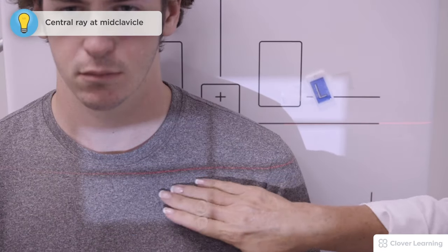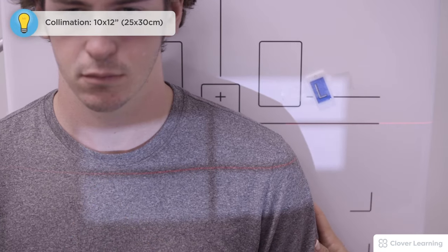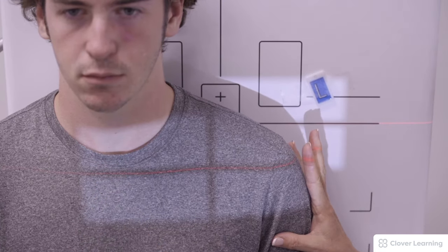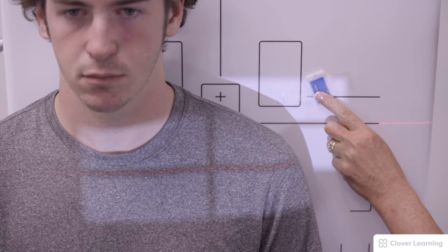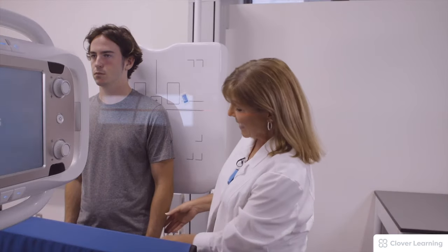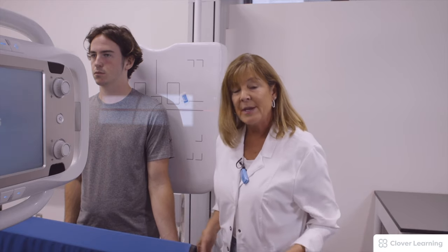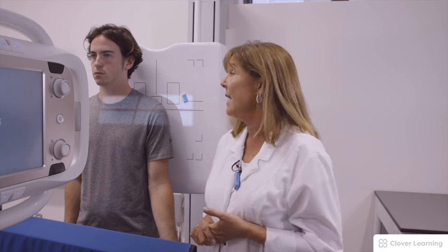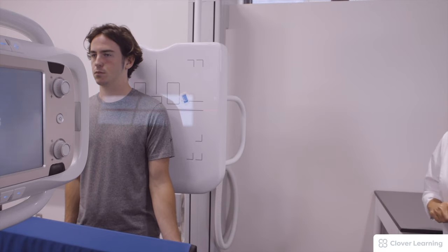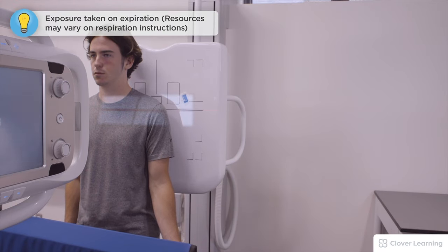The central ray is centered right to the clavicle. We're going to keep our collimation open and center right here in between the jugular notch and the lateral portion of the shoulder. We're putting a left marker on the left side. The patient's hand will turn forward into anatomical position. The patient will take a big deep breath in, let their breath all the way out, hold very still, and the exposure is taken.